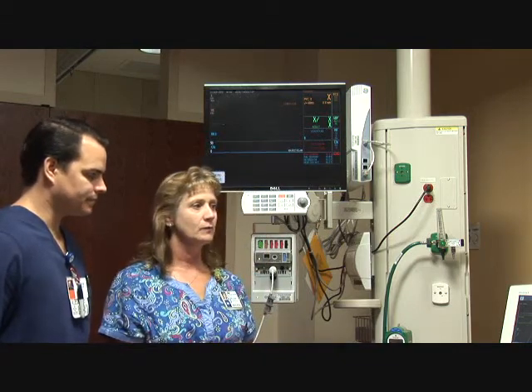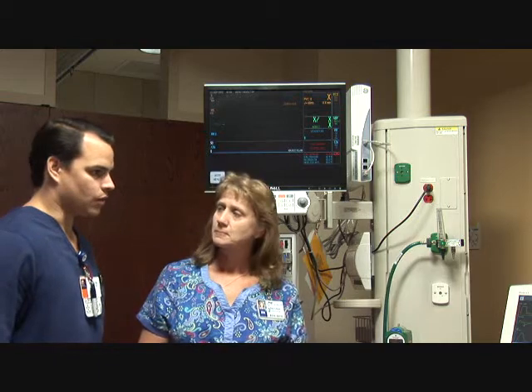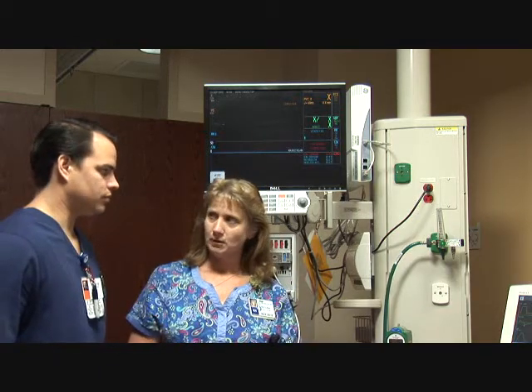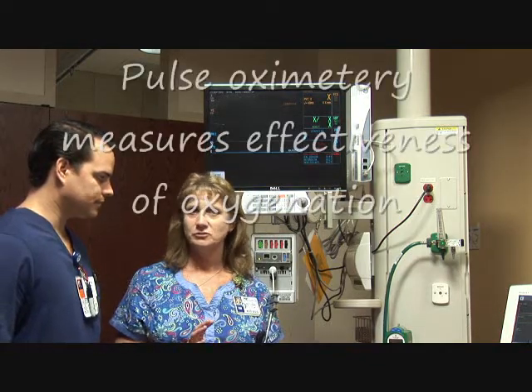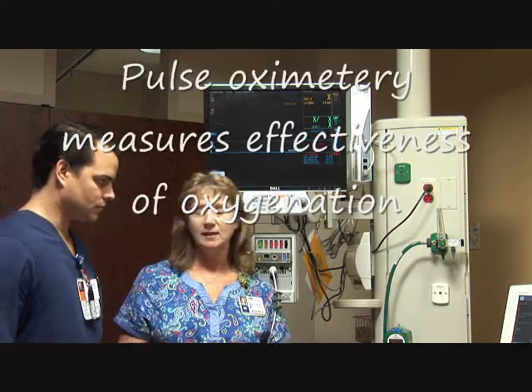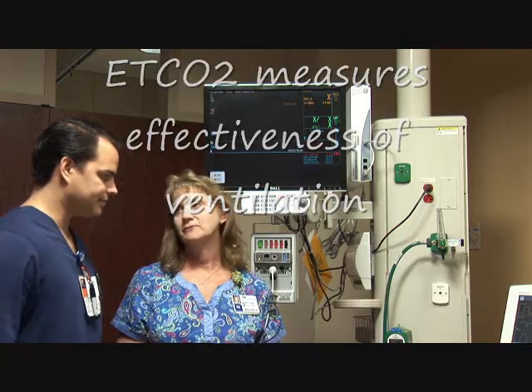The reason why we would like for you to do pulse oximetry and CO2 at the same time, do you know why we want to do that? For oxygenation and ventilation? Correct. The pulse oximetry measures O2 saturation, and that tells us oxygenation within the lungs and in the body system. And the End Tidal CO2 is used to monitor ventilation.